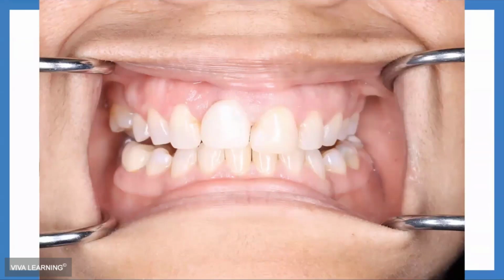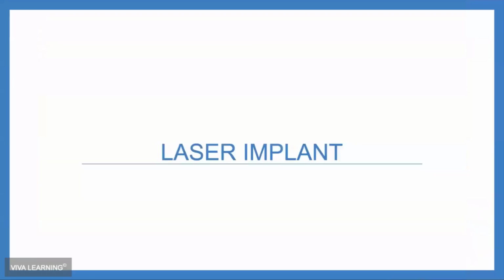I will probably remake this crown at some point, but we're going to get through her other restorative work first, and come back to this crown once she's had it for several months, and we can discuss what she wants to change. I think obviously the color needs to come down in value a little bit, but if there's some contours we can change, we're going to discuss that before remaking it.